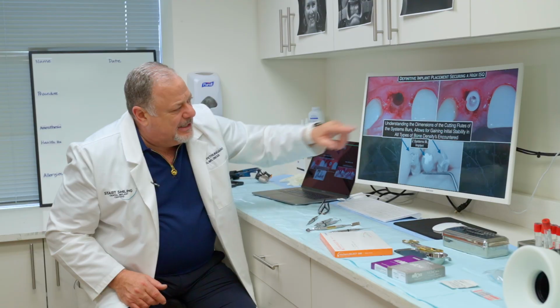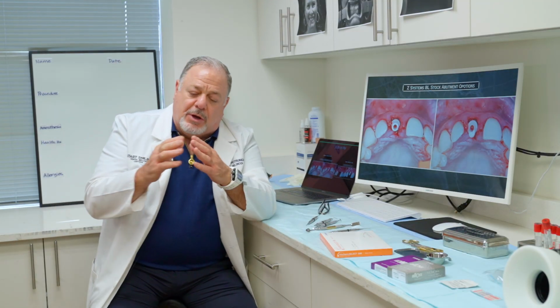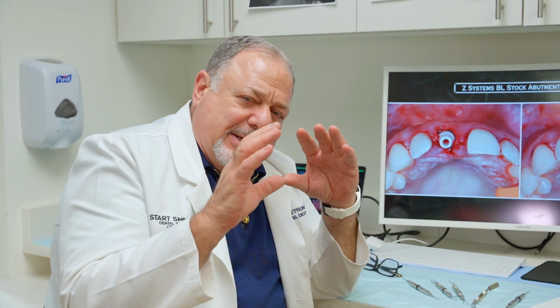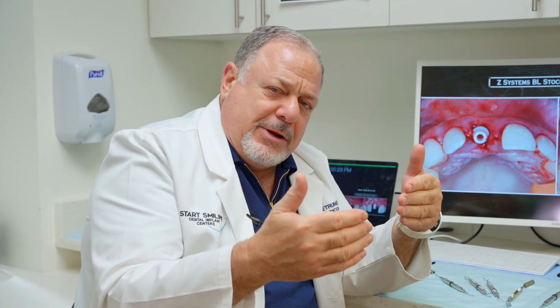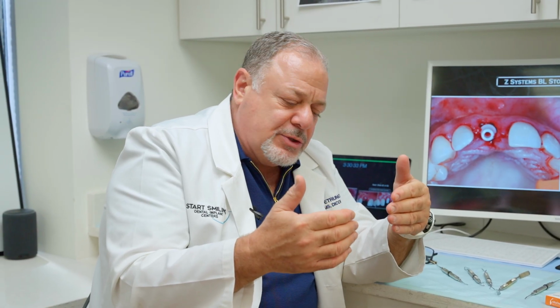So here's our implant then seated into the site, and it's seated to the ideal depth. So if we even go back to what we talked about, and I did it in publications in the past, we're not going to bury our implants to the bone. We're going to place our implants in the ideal position at the facial contour bone to the contralateral tooth. I wrote that back in 2005 in Practical Periodontics and Aesthetic Dentistry. We're not going to place the implant deeper. We're going to place the implant ideal, especially with zirconia.